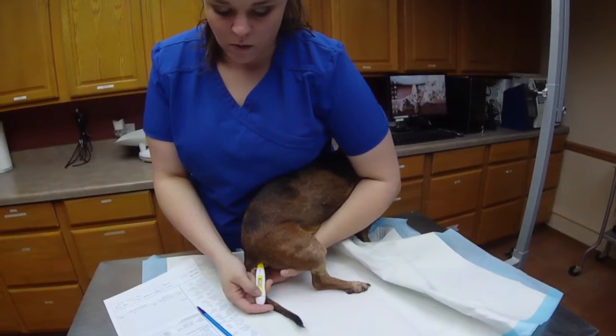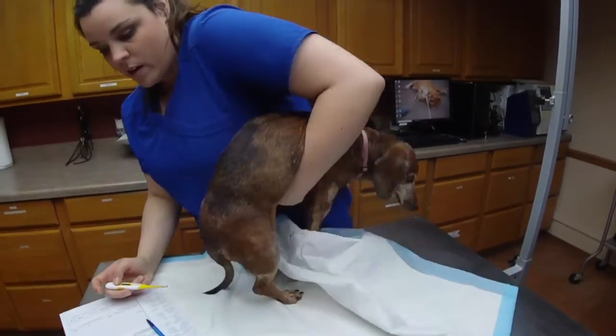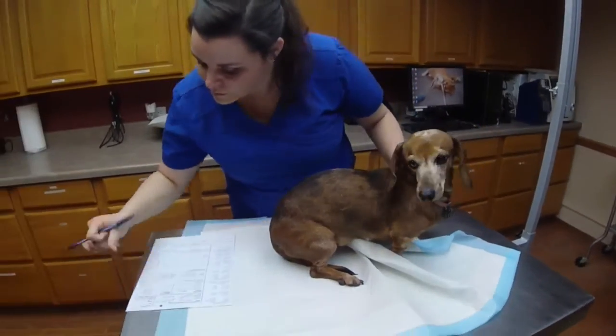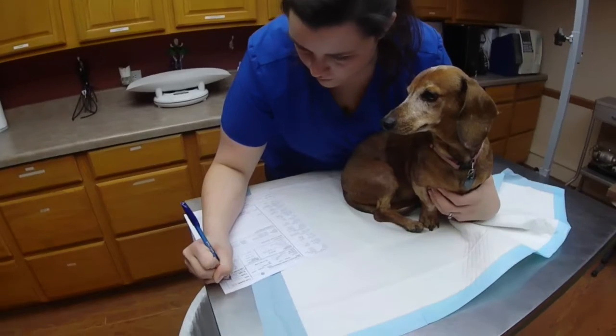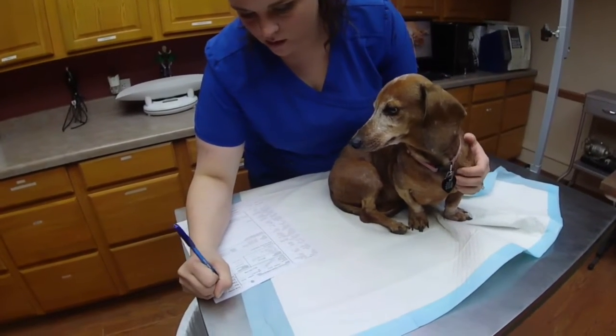And it's reading at 101.4. Normal for dogs is 101.5. So she is good there. You bunched this all up. We'll record that. Eats Hill's Science Diet.